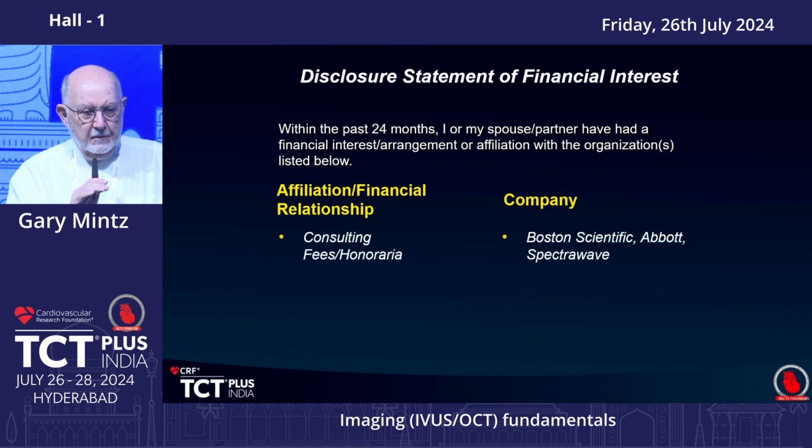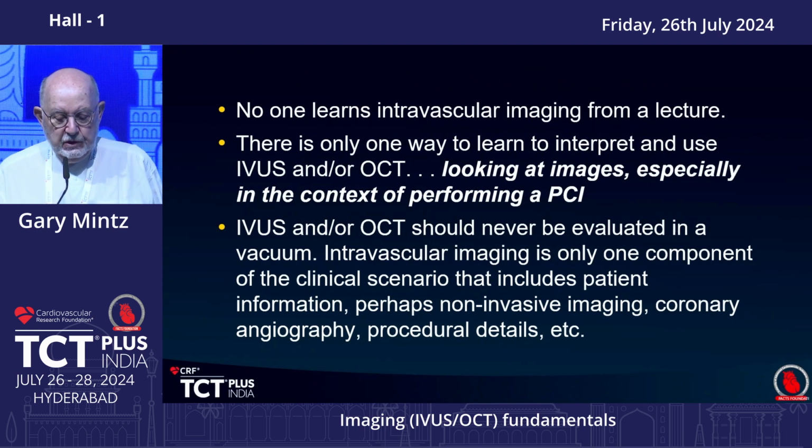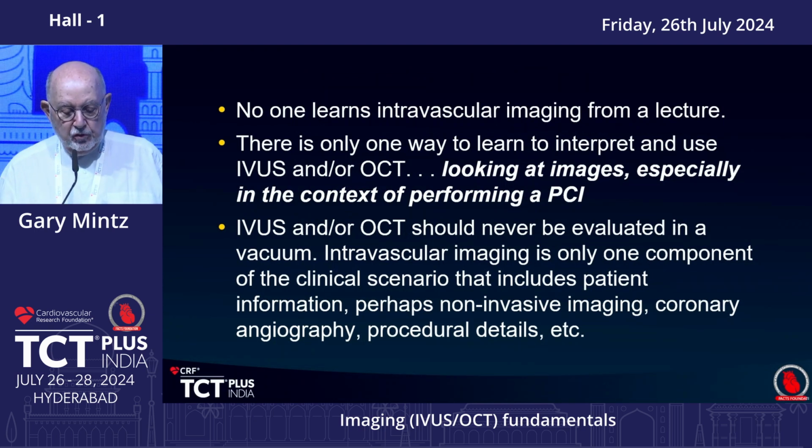So I'm going to talk about fundamentals of intravascular imaging. These are my disclosures. No one learns imaging from a lecture. There's only one way to learn and interpret IVUS or OCT, and that's by looking at images and using them in the cath lab.